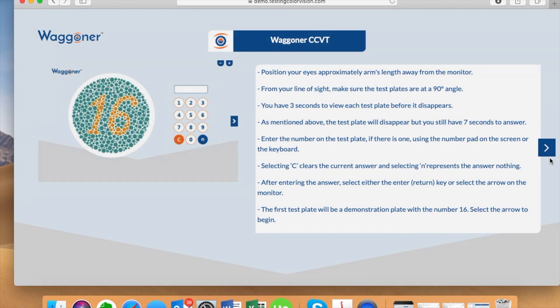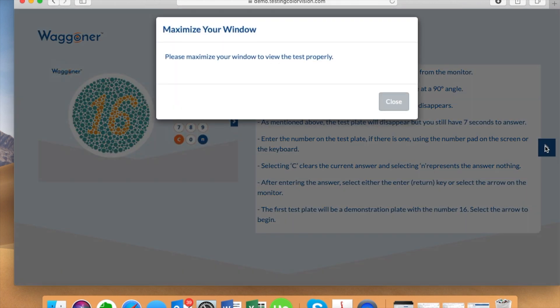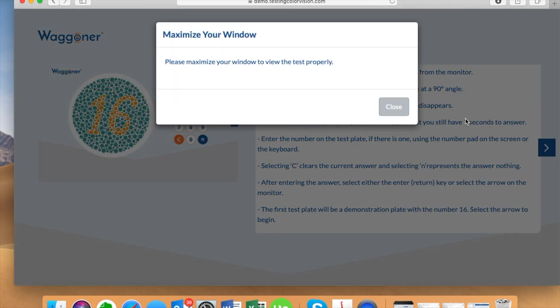A pop-up will appear asking you to maximize your window after you have selected the blue arrow. To create the best testing experience, please maximize your window and select close.